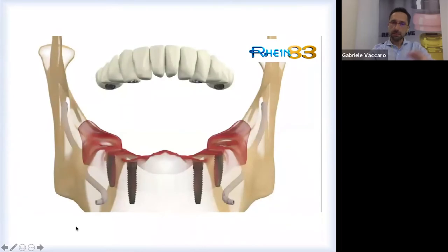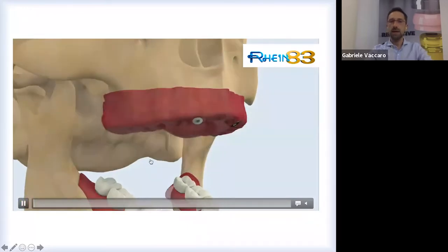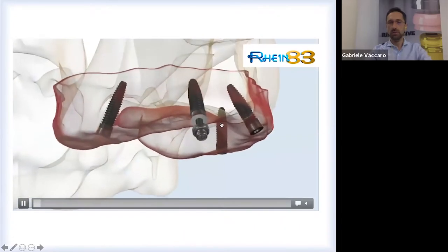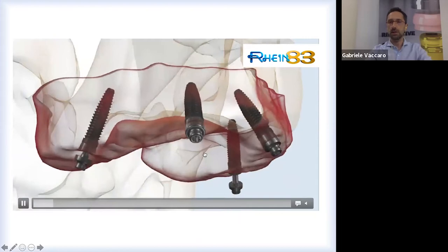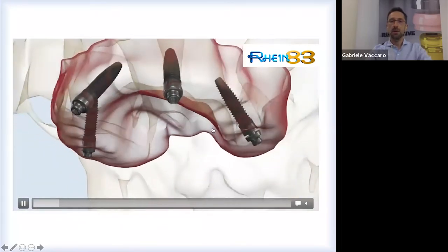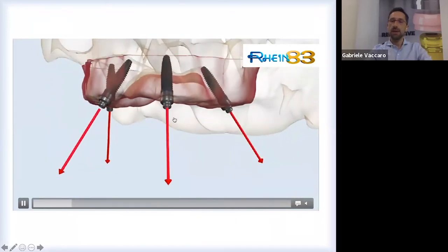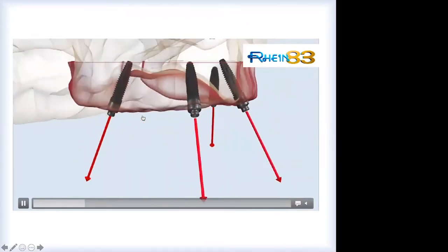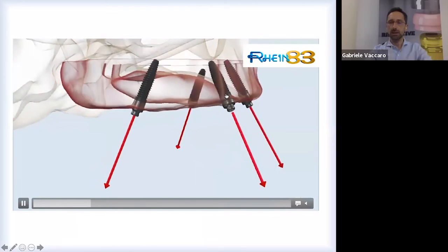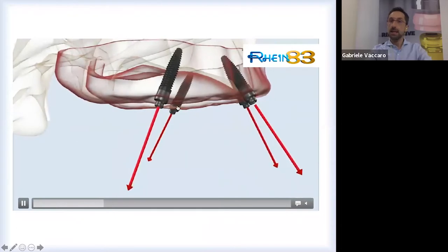the bridge. In some cases, as often occurs in the upper jaw, in the maxillary bone, and we are going to talk more in detail about this, we have the opportunity to avoid the screw in the frontal incisor or in the canine. Why can we do it? Because when you have this strong disparallelism, it's an advantage for this system, because we have a stronger lock. We have a stronger lock between implants and the framework.